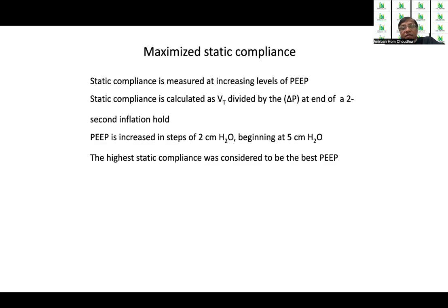Now, as I told you, this is the change in plateau pressure at the end of a 2-second inflation hold. Similarly, we can also look into the driving pressure, because as we note today, plateau pressure minus PEEP gives the driving pressure. If we try to reduce the driving pressure so that it is maintained below 15, and we see that with our ventilatory strategy the driving pressure is gradually reducing or at least unchanged and below 15, then it can be inferred that the ventilatory strategy is working, and the PEEP at that point of time can also be considered optimal PEEP.